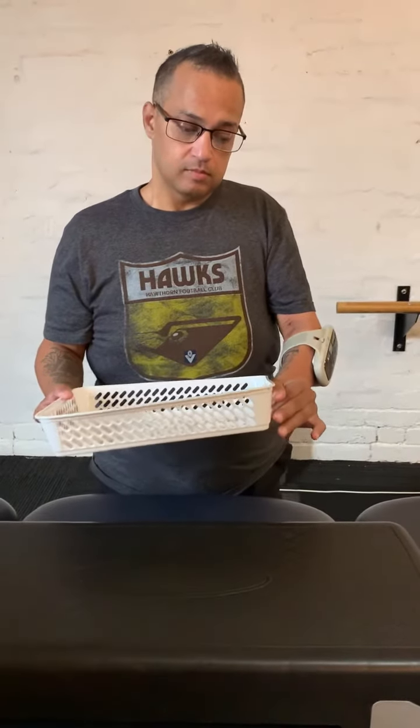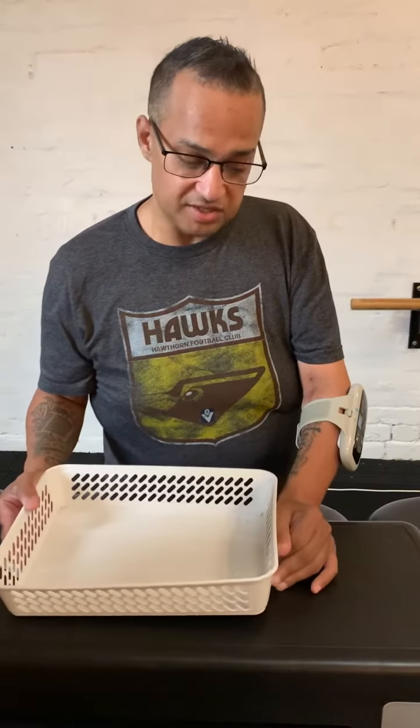Relax your hands. Do it one more time. Step forward. It's me placing a basket on the table for the first time in six years after having my stroke.